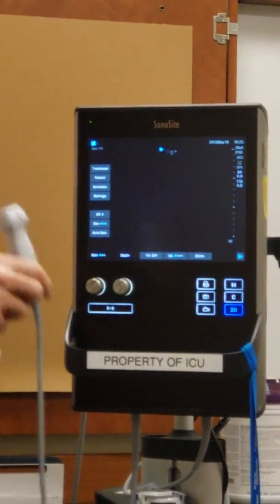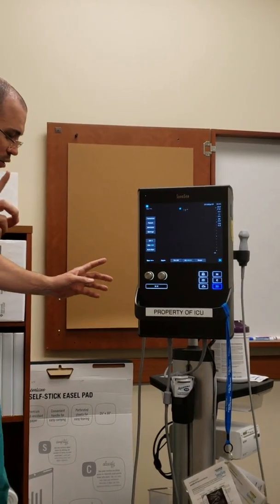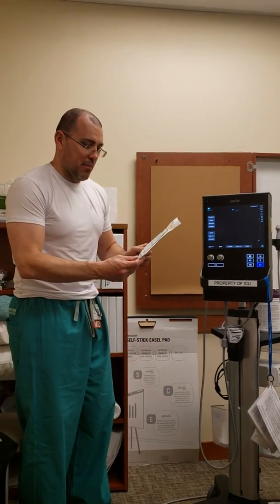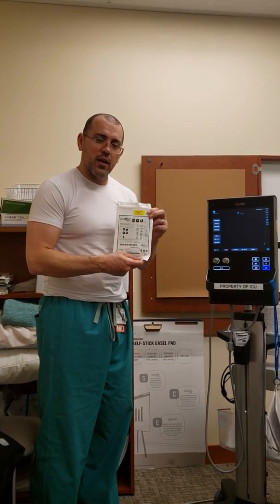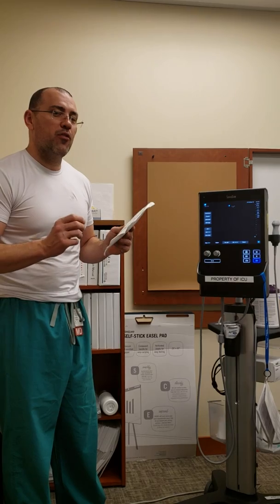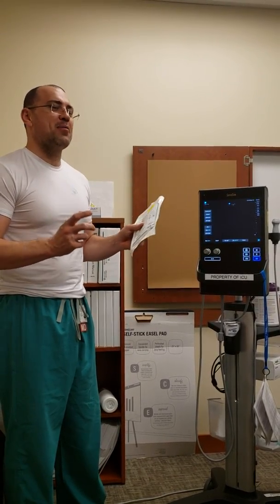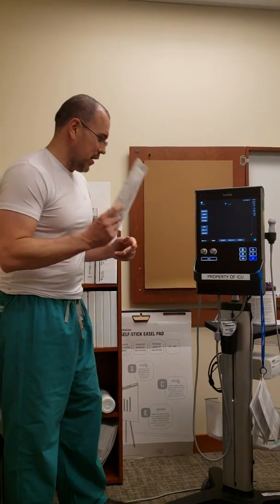I think that covers the bullet points of the ultrasound machine. One last thing — when we turn this off, the ultrasound probe cover is in the back. We always use this to keep everything sterile. Also, very often our kits do not have caps or flushes, so always ask for those ahead of time. We often get the line placed and then realize we're missing caps and flushes. If you can get those ahead of time, that'd be very convenient. Thank you very much.